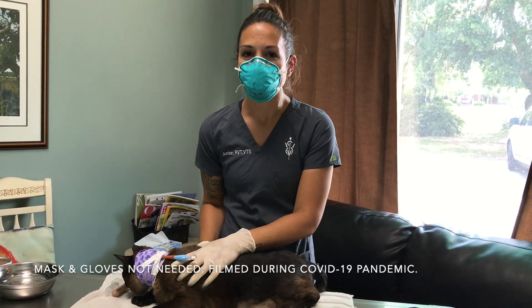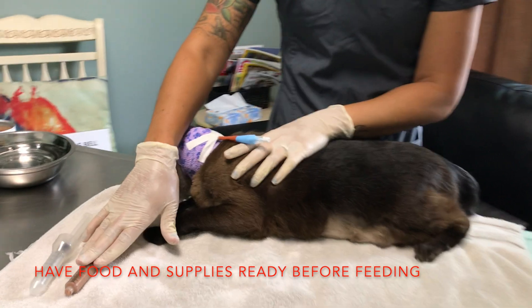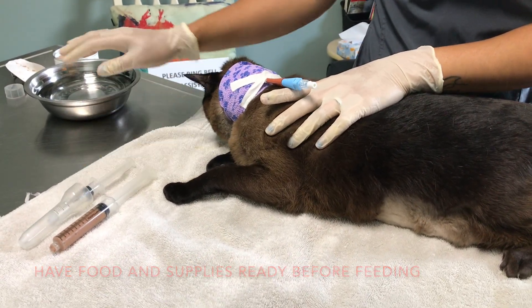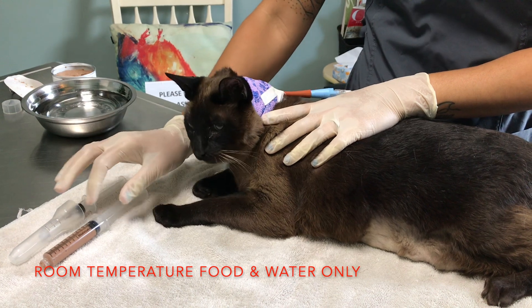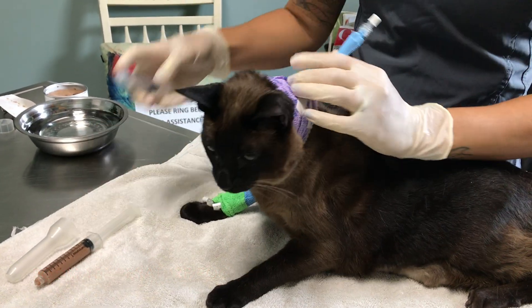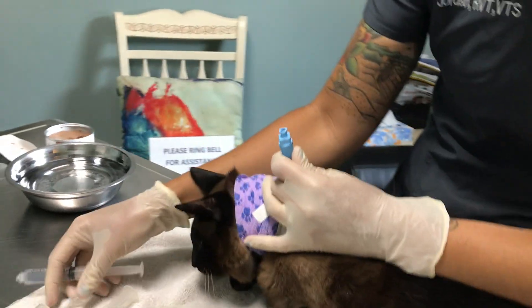I'm just going to give a little demo as to how to administer food and water through a feeding tube. We drew up the quantity of food that we would like him to get at this time, as well as a little bit of water and then a little bit of extra water so we can administer the water before and after each feeding. This food and water is both room temperature — we like it room temperature because too hot or too cold can cause him to become a little nauseated.